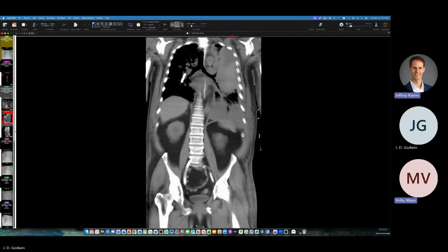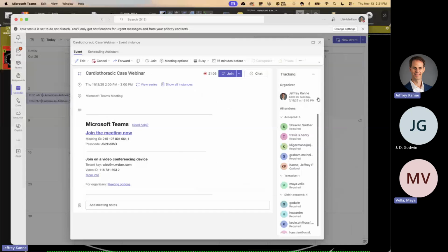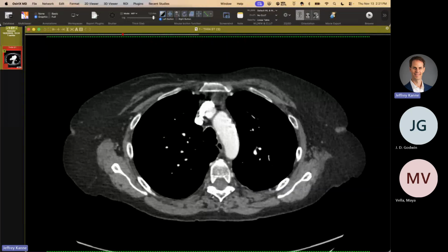But when I showed the figure of the dual chamber one last week, it's called the Aveir or something like that, on their website they talk about how you can retrieve them and replace them. Awesome. Thank you. We just haven't gotten to that time point yet. Absolutely.